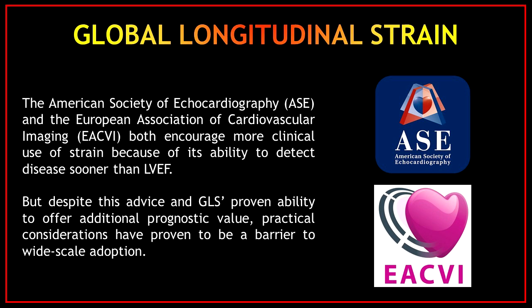The American Society of Echocardiography and the European Association of Cardiovascular Imaging both encourage more clinical use of strain because of its ability to detect disease sooner than left ventricular ejection fraction. But despite this advice and GLS' proven ability to offer additional prognostic value, practical considerations have proven to be a barrier to wide-scale adoption.